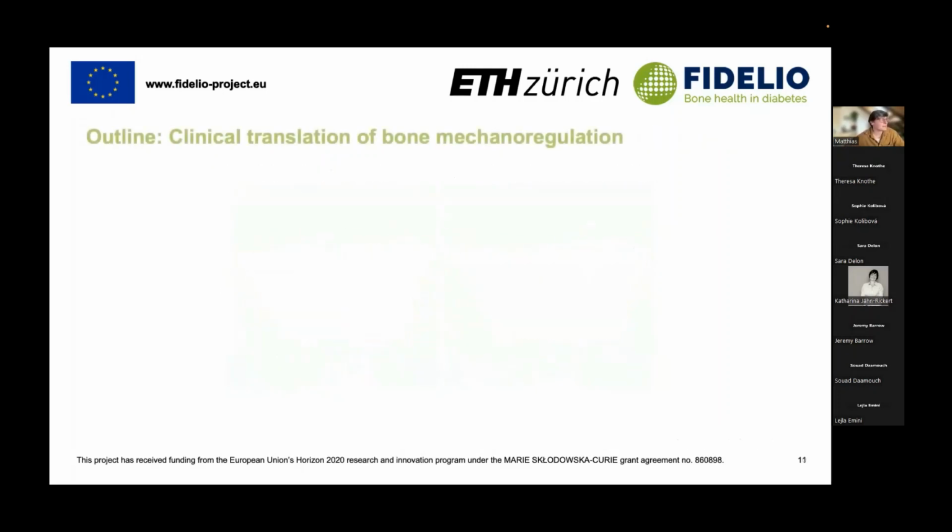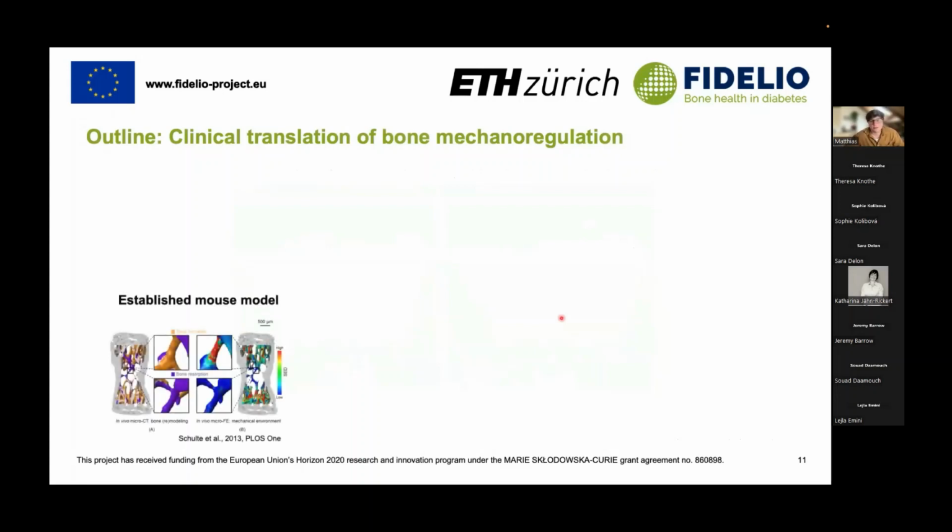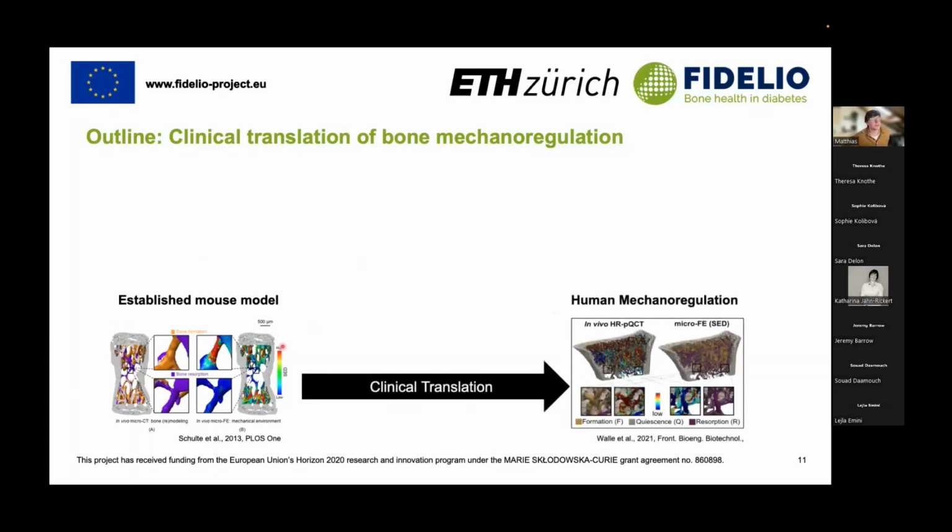And yeah, of course, these models are very sensitive and have been developed basically for mouse models before, and studied a lot in different applications, even fracture healing or defect healing with different loading regimes and so on. But these models come out of very controlled experimental conditions in these mouse models. And now studies are trying to translate these models for a human application using HR-pQCT imaging.